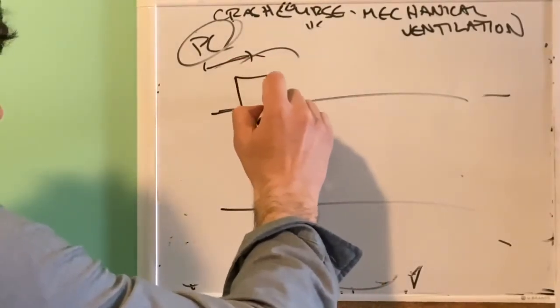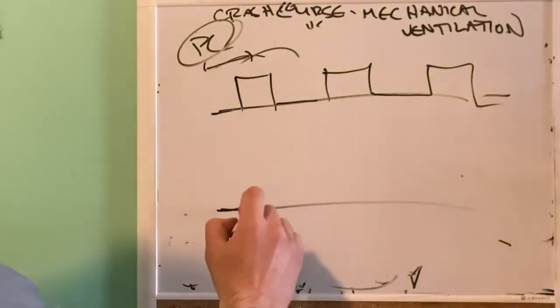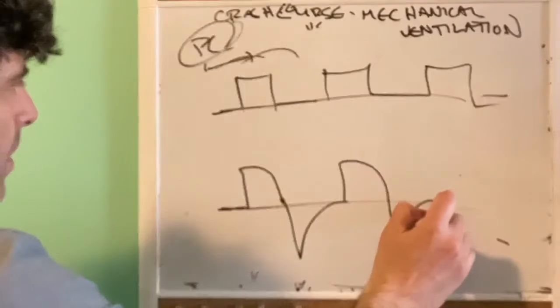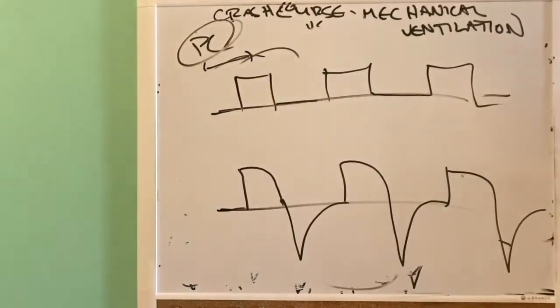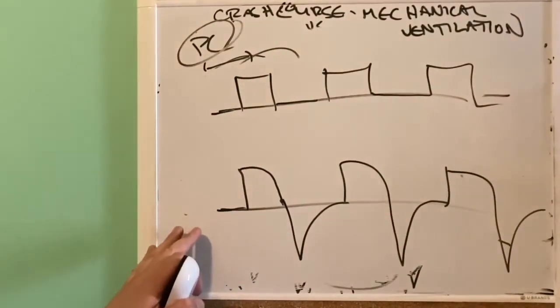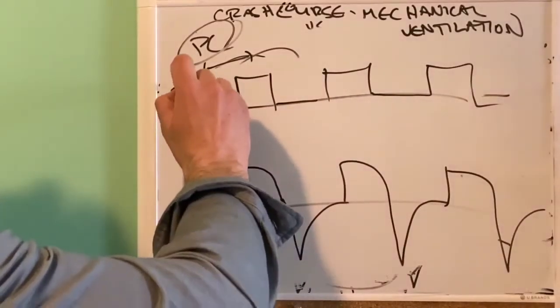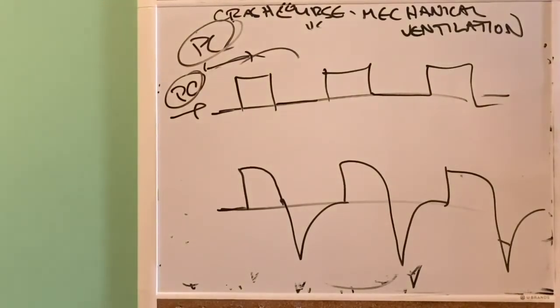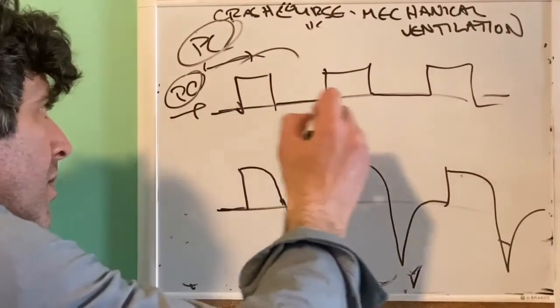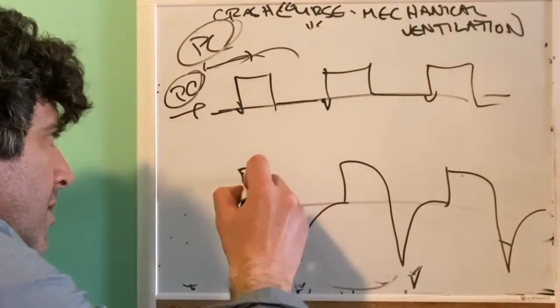Let's say I have this. And this is another. So I don't even have to label it. If I say, what is this, a pressure mode or a volume mode? You should be able to look at this and say, okay, this is obviously a pressure mode. And what looks abnormal? Now that you're looking at the patient and they're awake, really they should be triggering here. So what's going on? Well, you know that it's supposed to look like this.